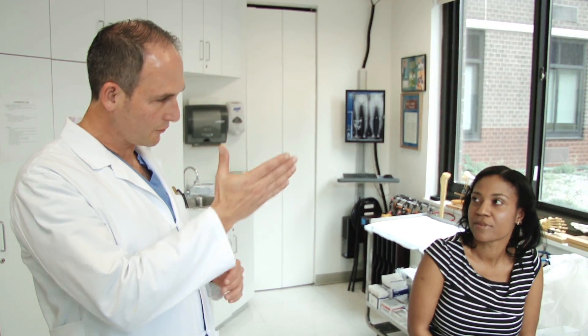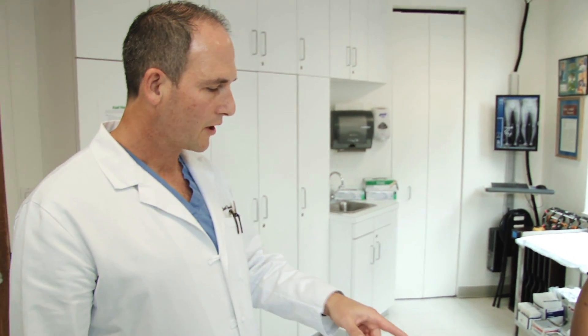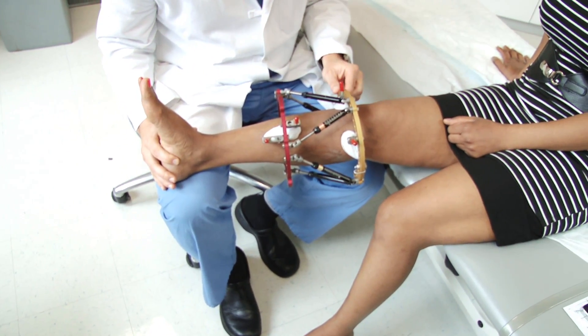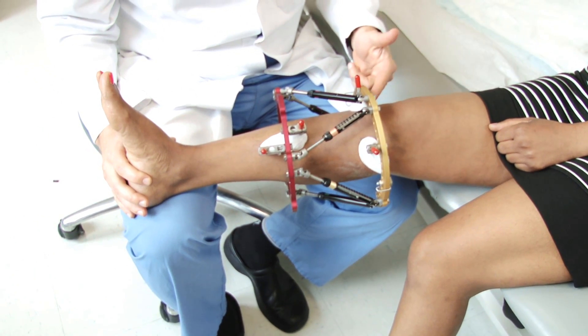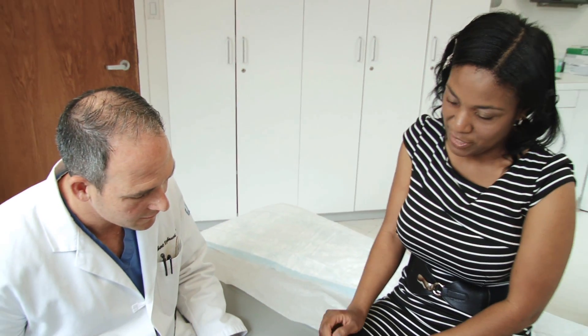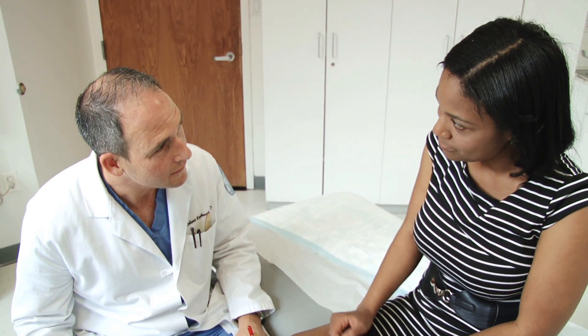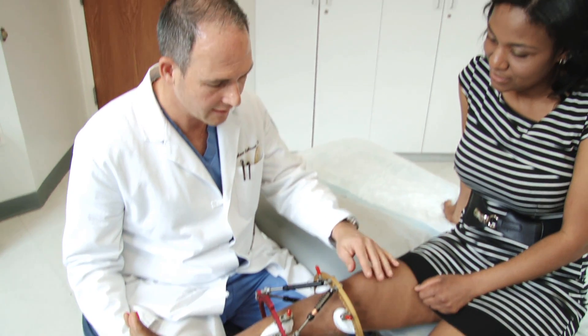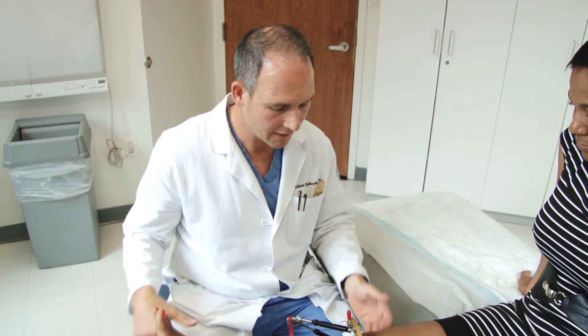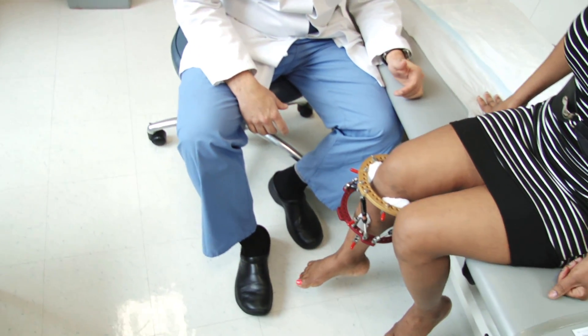We're about three and a half weeks out from the surgery to correct the bow leg deformity, and you just completed your adjustments a couple of days ago. You started off with a bow leg, and this surgery — we did the osteotomy to correct the deformity. I want to go over a couple of things on the fixator and then show you your x-rays. You're doing a great job with your pin care — I can see you've been cleaning them and have the rolled gauze around the pin sites. How's that been going? There's no more drainage — it's just dry, so you're just cleaning it with the peroxide. Wonderful.